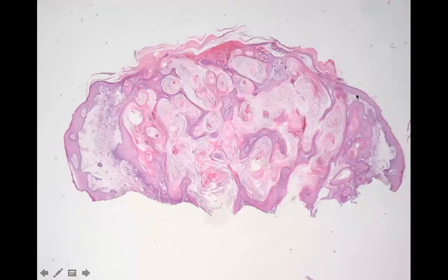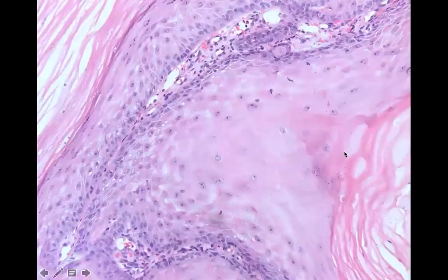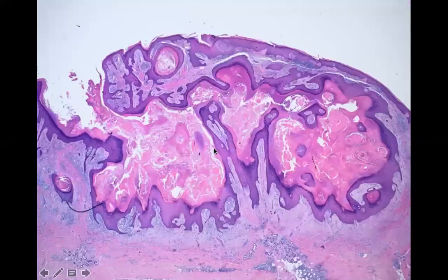Here's a lesion that's older. That was an early KA. As the lesion gets older and starts regressing, those epidermal changes start to shrivel in. Once they start to shrivel in, you see only orthokeratotic change. Here you see these changes of atypia are very minor, almost less than you might see in an actinic keratosis, but they're still big and glassy pink.